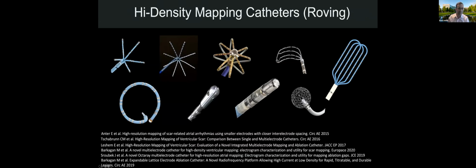But nowadays, and I'm grateful for all of these catheters because they helped my career and helped many of the fellows in my lab, we can describe any of those catheters. From the pentarray to a more sophisticated iteration of the pentarray called the octarray and the Orion catheter. And now we have the grid catheters. Obviously we have the circular lasso.